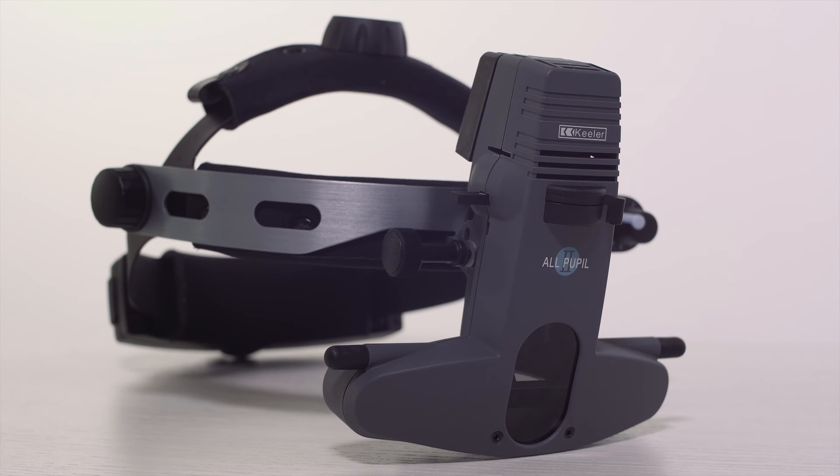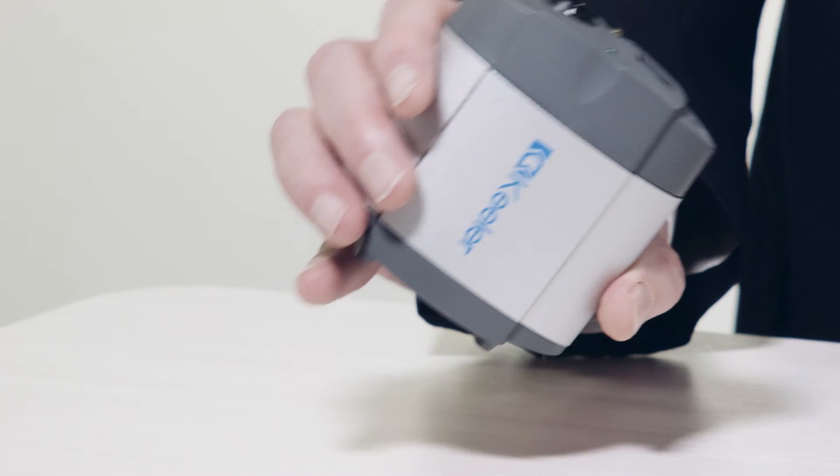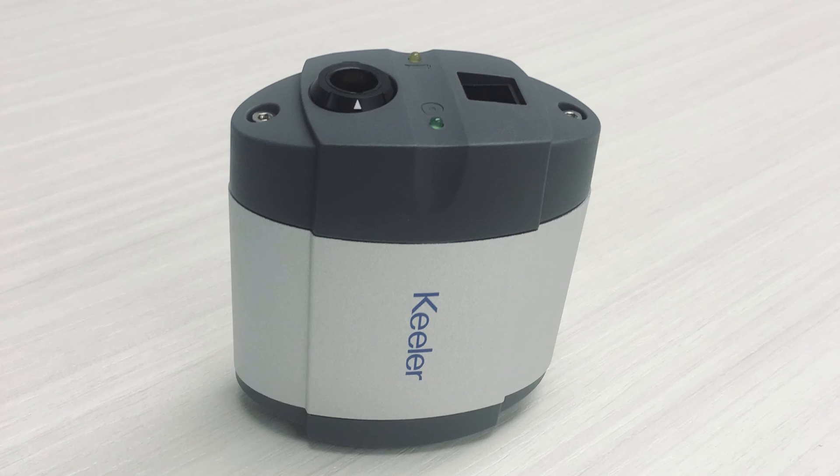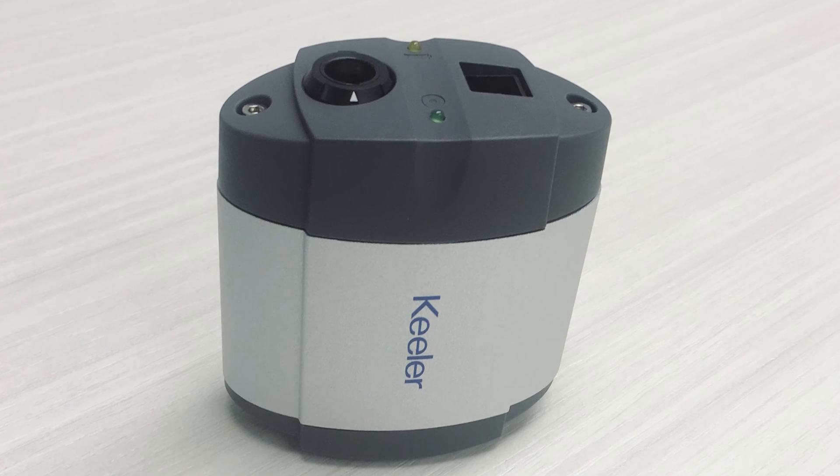All Pupil 2 or Vantage Plus wired units can be powered using the SmartPak for mobility. The metal hydride battery allows you hours of use before you need to recharge the battery. The SmartPak converts to a wall-pack system.